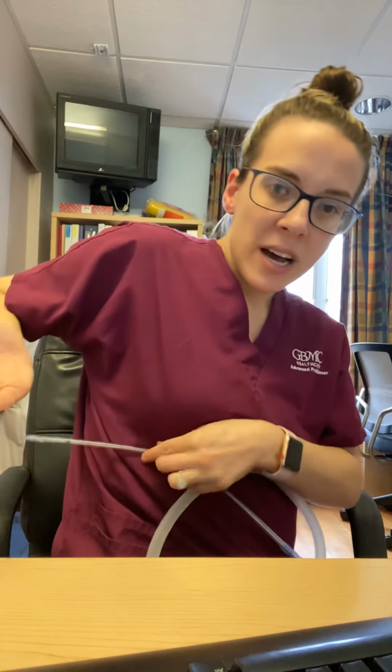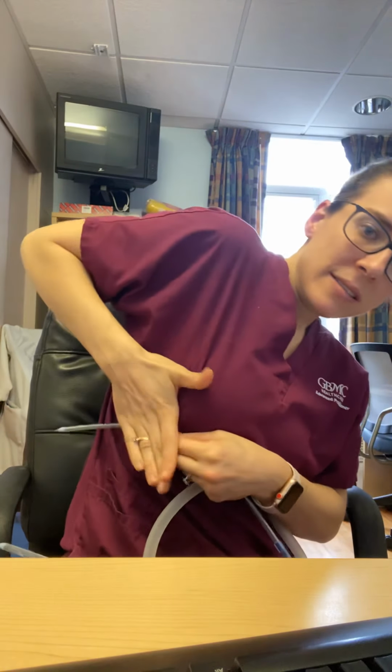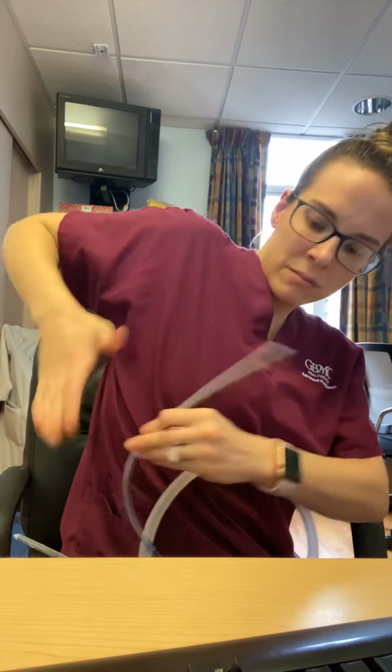So my chest tube is cut. I have the patient lying flat. I sandwich the dressing against the skin, and then I have them take a deep breath in, blow it out, and I pull, and my dressing is already in place. Some people have people hum, hold your breath, blow out. It doesn't matter, just as long as it's some type of Valsalva or breath holding or exhaling maneuver, and you're keeping a dressing in place as you're withdrawing.